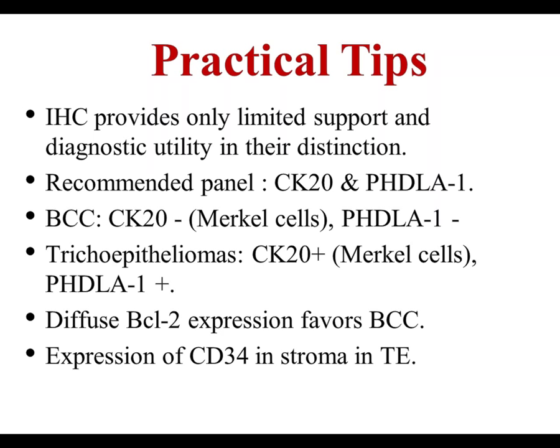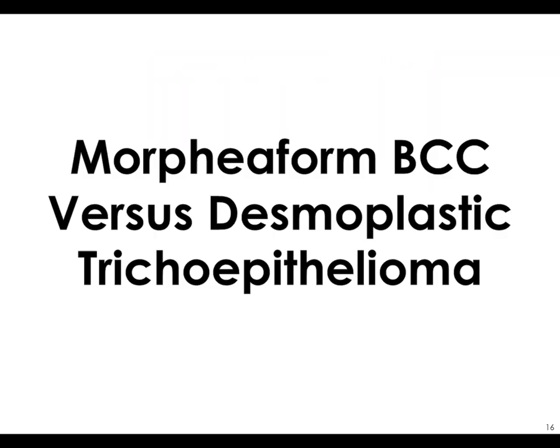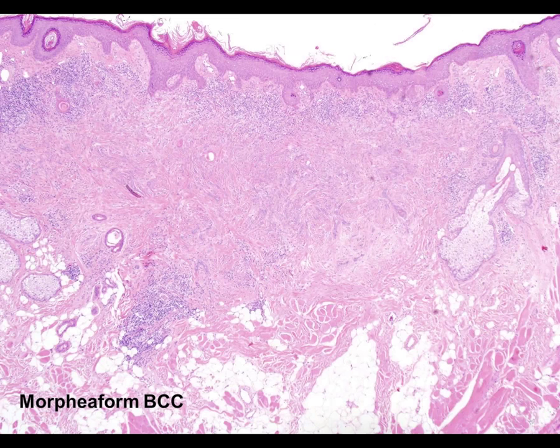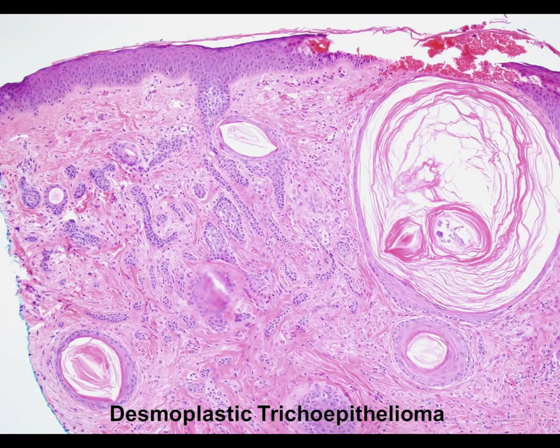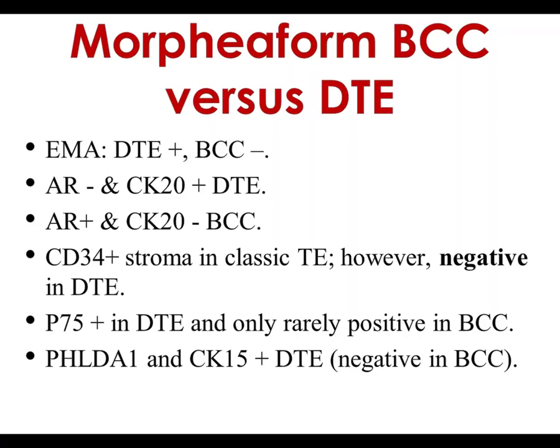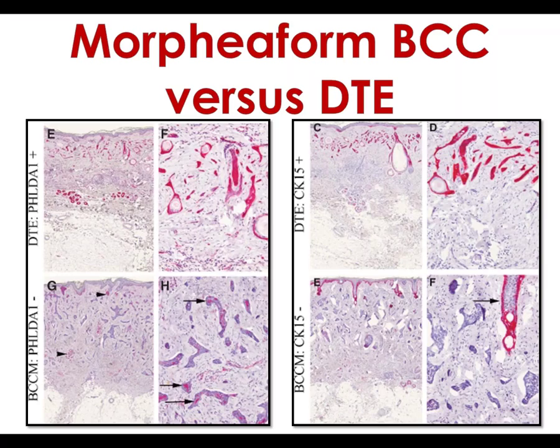The same story applies when trying to separate morpheaform or infiltrated basal cell carcinoma versus desmoplastic trichoepithelioma. Here we have an example of an infiltrated basal cell carcinoma showing infiltrative nests with desmoplastic stroma — easy to diagnose with a decent biopsy. Desmoplastic trichoepithelioma is also easy if you have a punch showing the base of the tumor. However, with a small shave biopsy it can be very challenging. In my opinion, CK20 is a fairly useful marker for this distinction, and PHLDA1 is also useful — desmoplastic trichoepitheliomas tend to be strongly positive and basals tend to be negative.